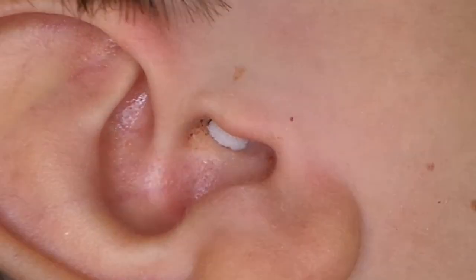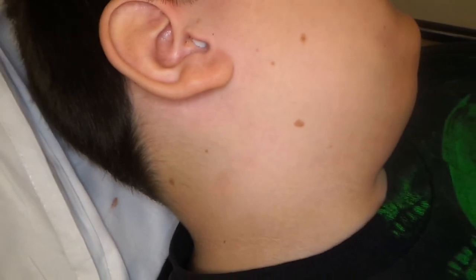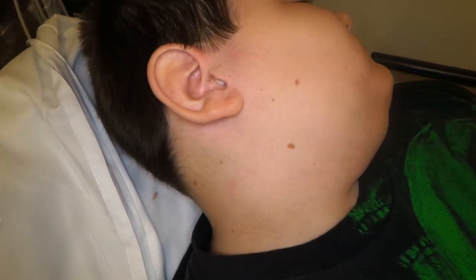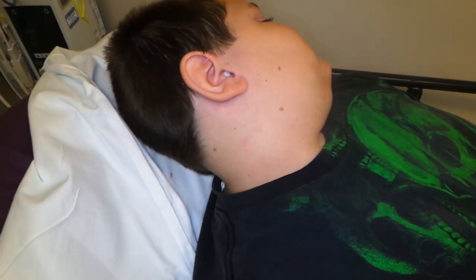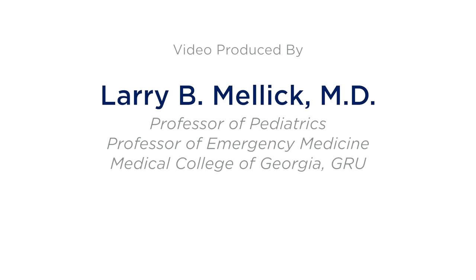How's it feeling? Is it feeling better? Yeah, they start to feel better already. So that's how you do it. Mom, you're gonna put the drops in four times a day, about three or four drops.